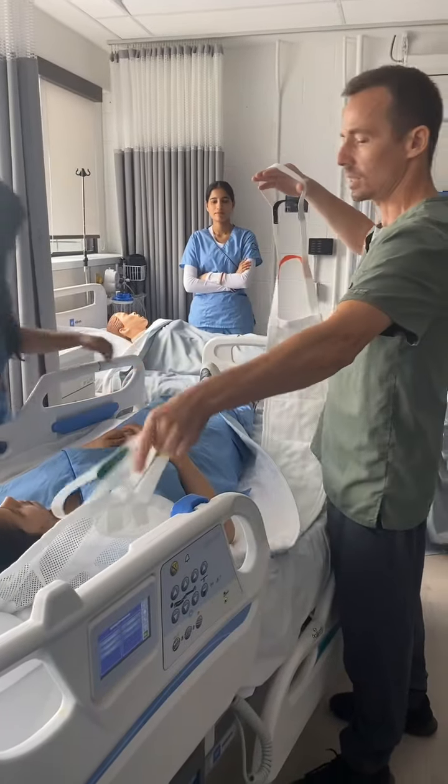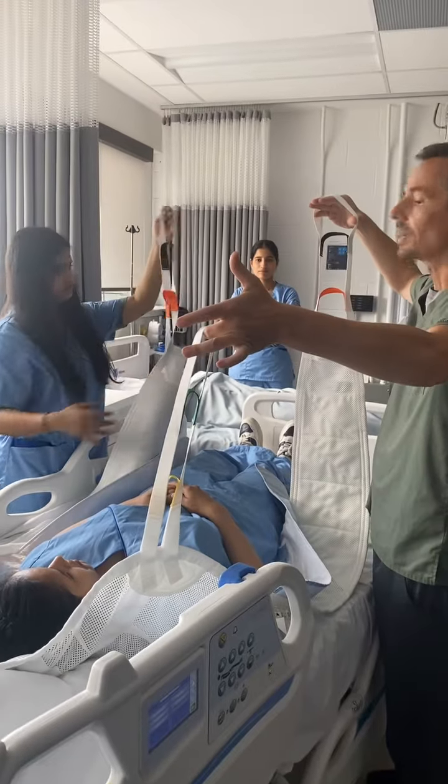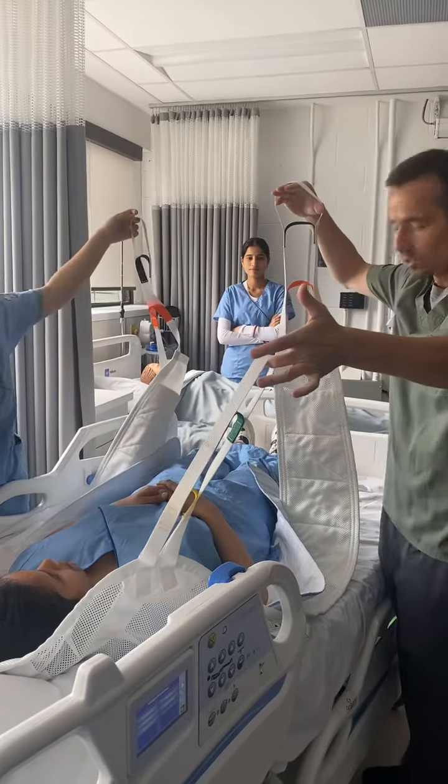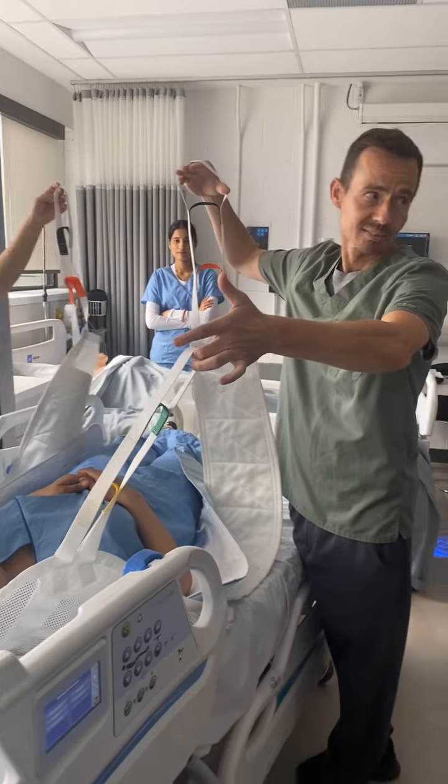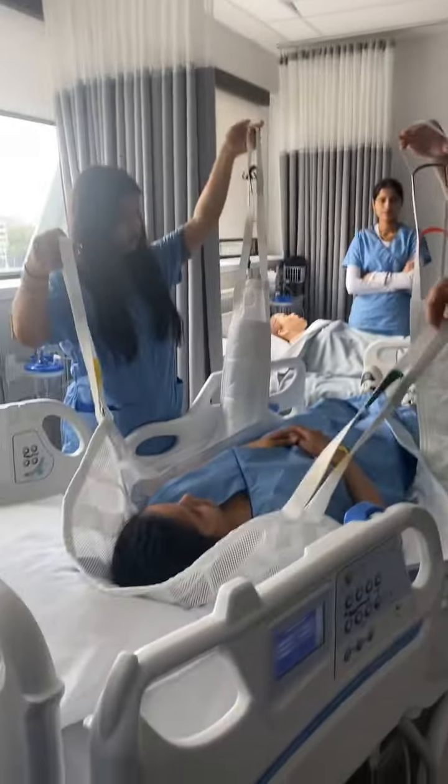Can you lift these ones up? Just like I do. Lift this one up like this, and the other side too. So if you attach the hooks like this, what's going to happen to the patient? They're going to fall through that hole, right?